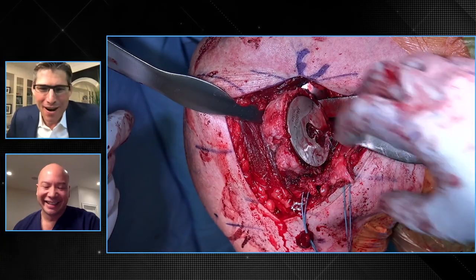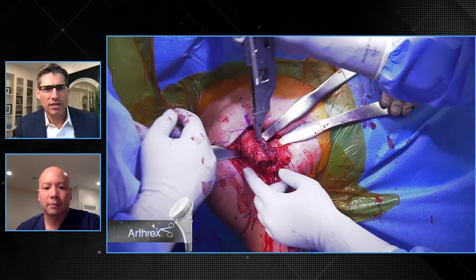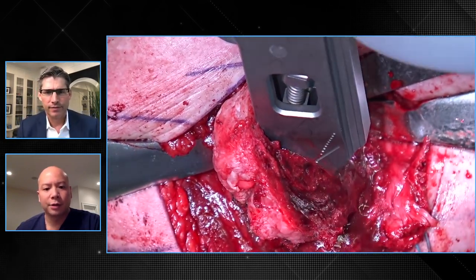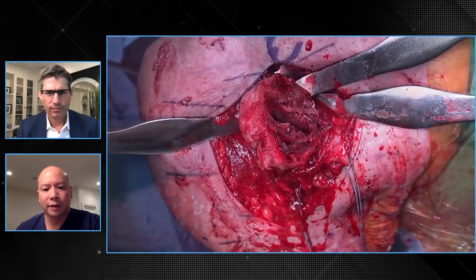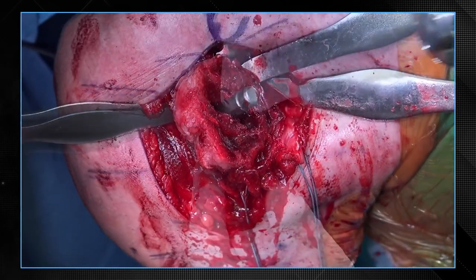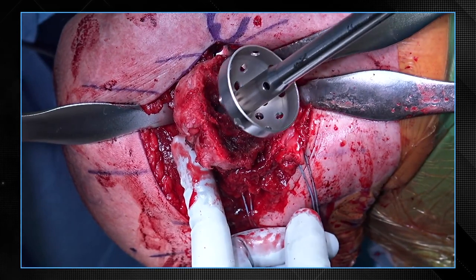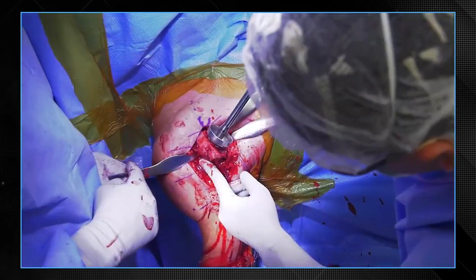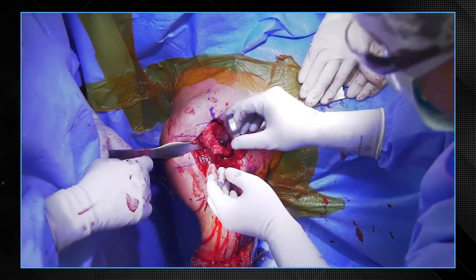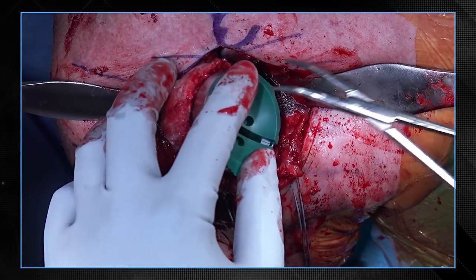It looks like you're preparing the humerus now and you're doing a short stem here. This system has some options — why don't you describe them as we go through watching you machine the humerus? Short stem for good bone, just for bone preservation — poor bone, I'll use a longer stem. The fixation here was excellent. We're preparing his metaphysis for the inlay humeral system, and there's a central position — you can bring that centrally, posterior offset, or anterior offset — just to accommodate anatomy, because everyone's a little different.